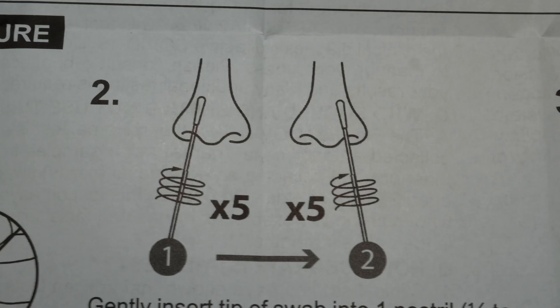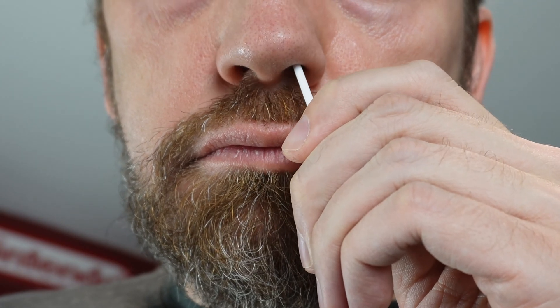You're going to swab both of your nostrils by doing a circular motion as seen here. Note it does not say to spin it — you're going to go around five times inside each nostril, and it says to take 15 seconds to do each one, so these are going to be very slow.